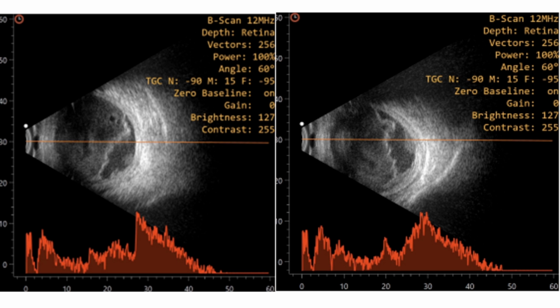You're not given any images which are showing any attachment near the optic nerve head. Yes, sir. If you're telling it's not mobile, then I would think definitely a retinal detachment. So it's the person who's doing the scan who can interpret. If you have not done it, probably you cannot opine on it. But whoever is reporting has to put down whether it was mobile, not mobile, attachments, and the reflectivity. All three you have to mention about any membrane.